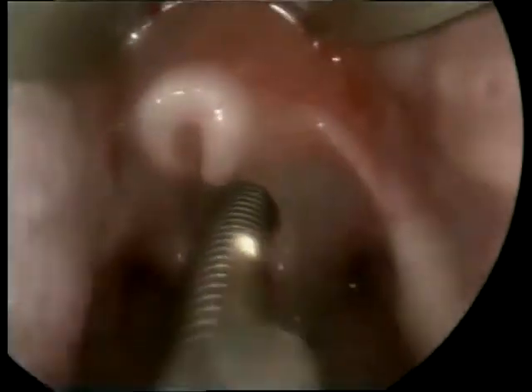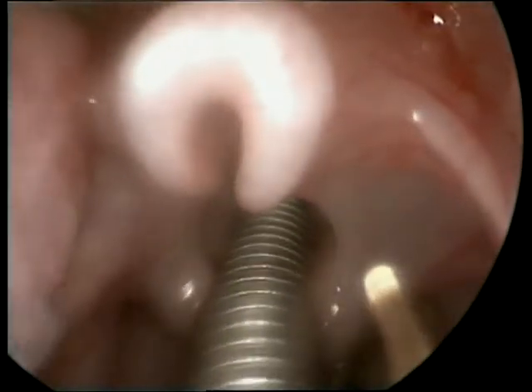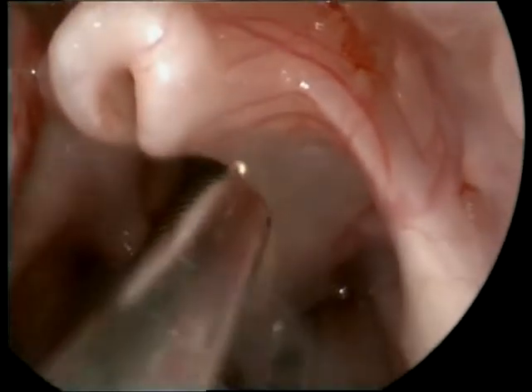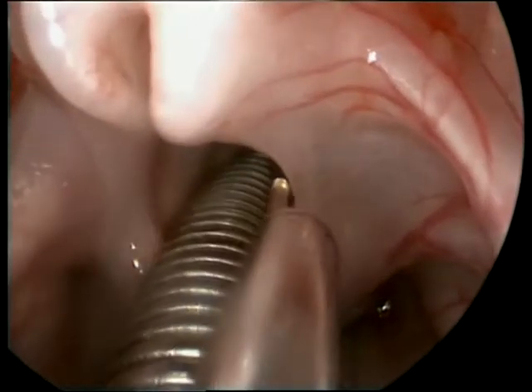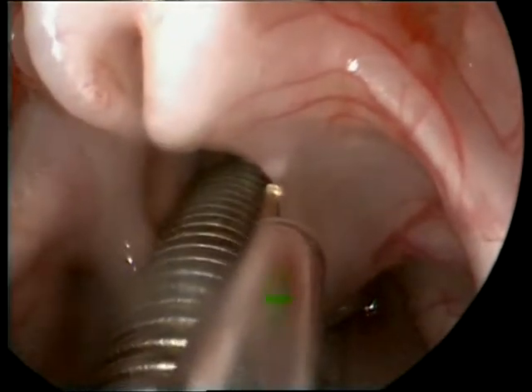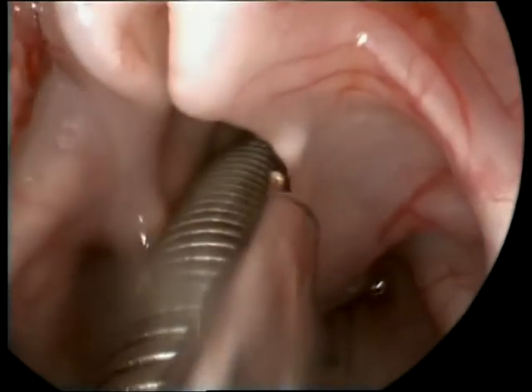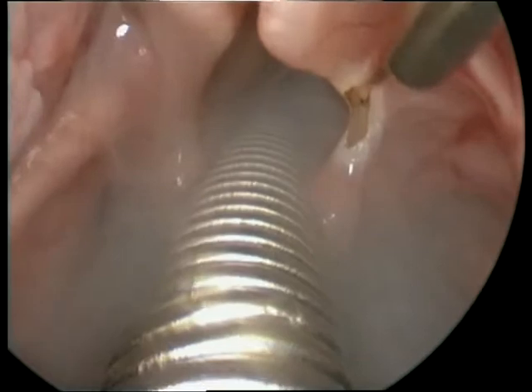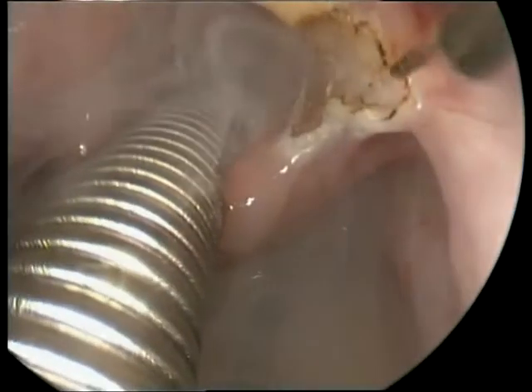At this stage of the surgery, the KTP laser probe set at 2.4 watts is introduced with the aim of cutting the aryepiglottic folds and cauterizing the redundant mucosa over the arytenoids. A laser-specific endotracheal tube made of metal is used for obvious reasons. The smoke needs to be evacuated so it will not obscure our vision.